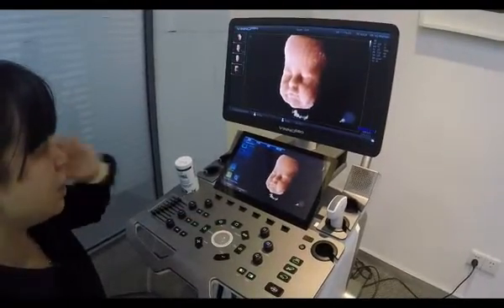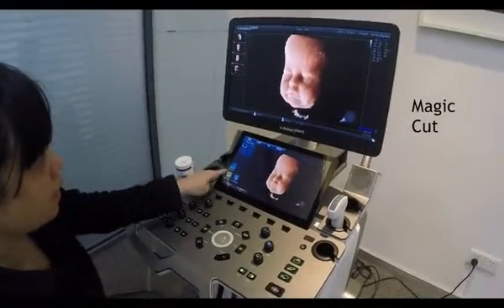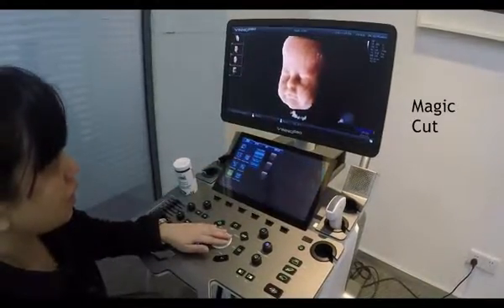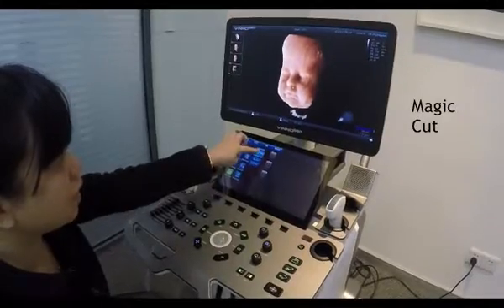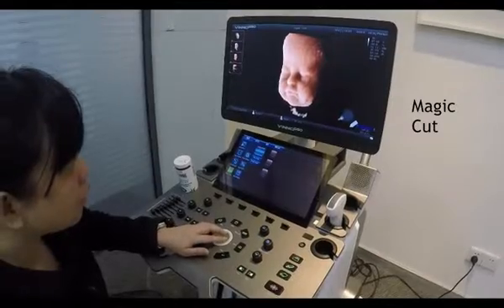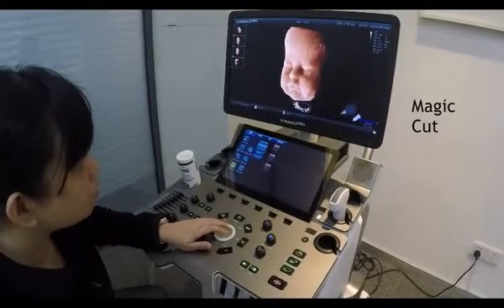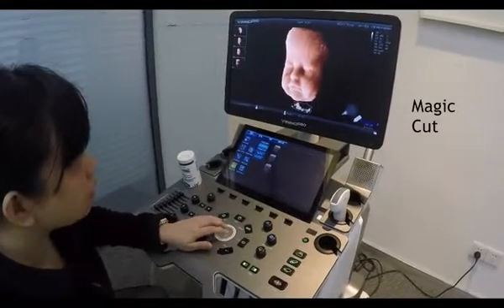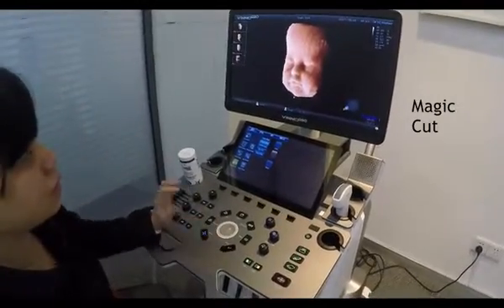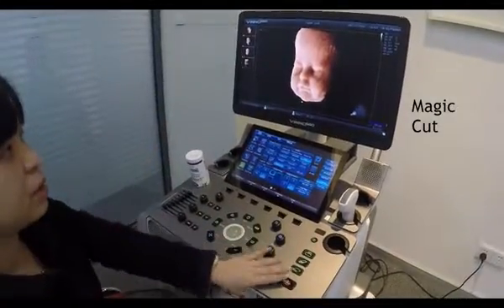Now I can see there are some artifacts that I do not want to see. I can go back to 3D and choose the Magic Cut function. I choose inside lasso and then move the trackball and press enter. I draw a border around the structure and cover it, then press enter again so the artifact disappears. So this is our HQ 3D imaging.